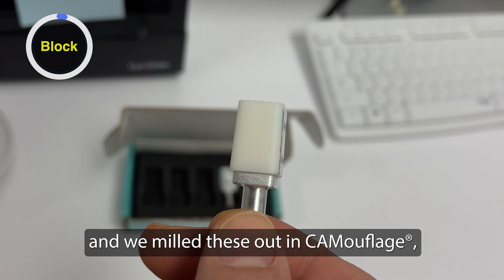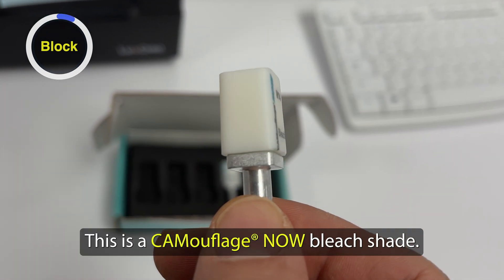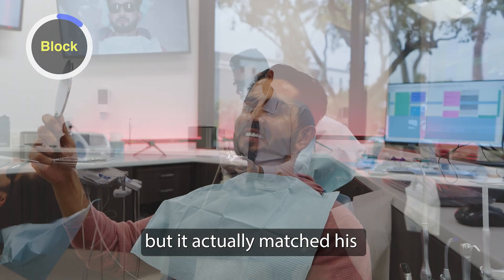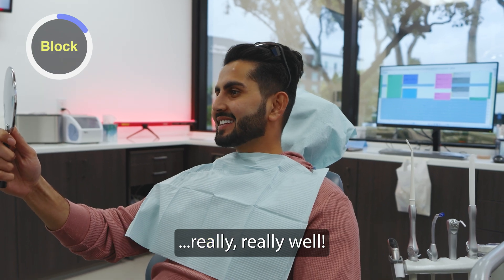We mill these out in camouflage. This is a camouflage bleach shade. We have one bleach shade that is super white but it actually matched his lower hypoplasia appearance teeth really, really well.